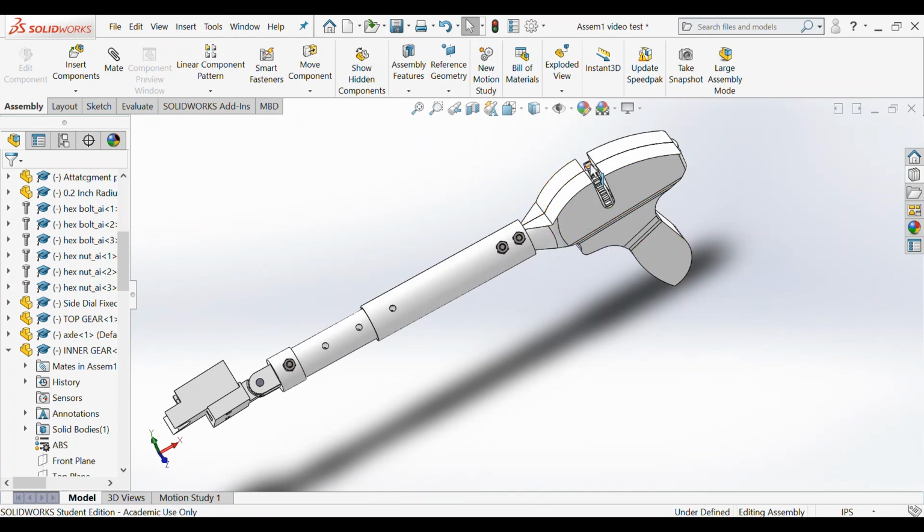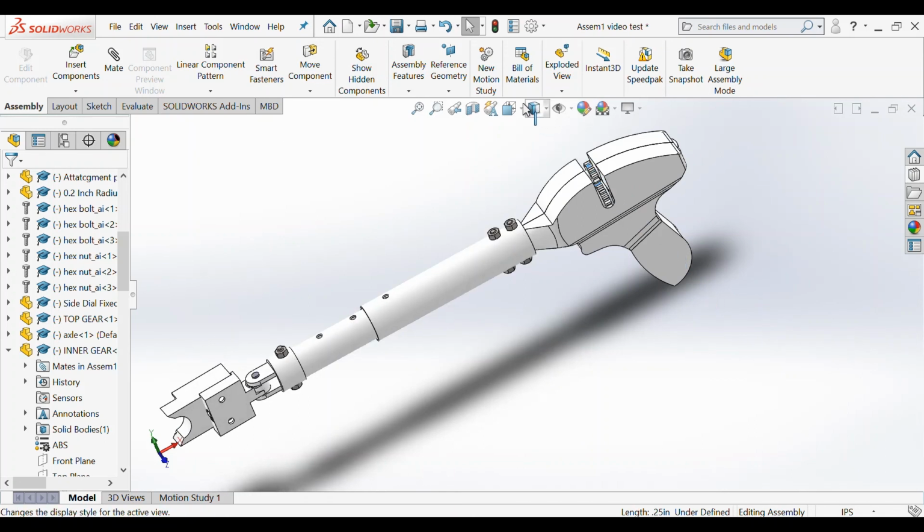As you can see, moving our gears fully rotates all of our components. Now this extender piece right here can be shrunk or extended depending on which hole we choose to align. And in our prototype, we connect them with a cotter pin.